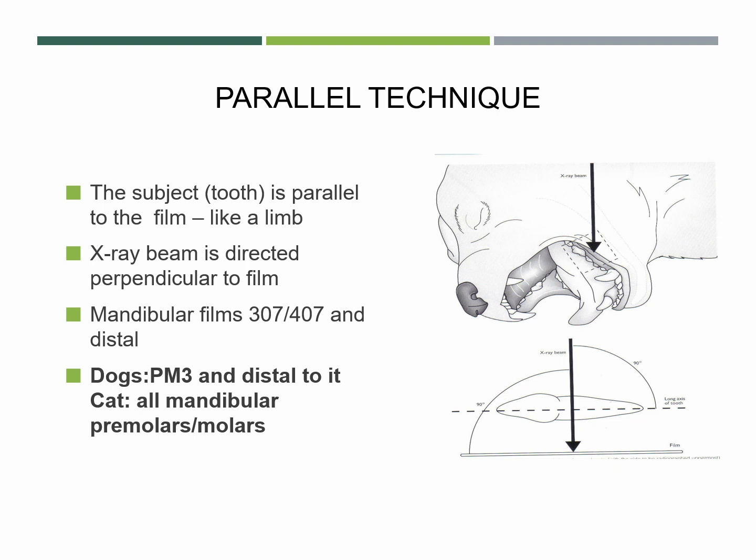And what that allows us to do is get that film, you're going to use little bits of gauze or paper towel to prop that film up so it's parallel with the tooth. And we're just going to move our cone head so it's parallel, just like we would with an x-ray tube, and take our x-ray. And Bob's your uncle, we should get something really nice.